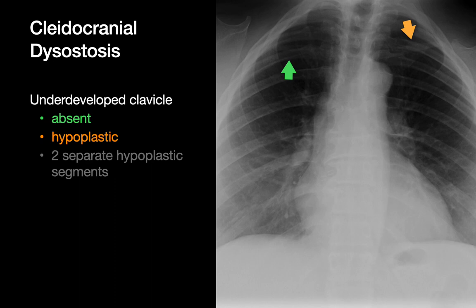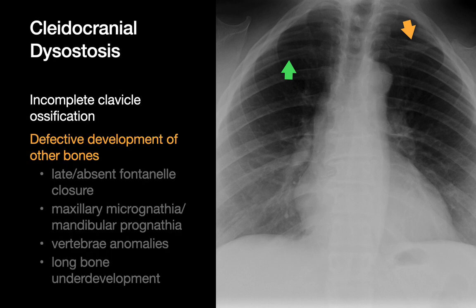Cleidocranial dysostosis is one of the two uncommon congenital chest wall variants to know. In folks with this disorder the clavicle may be entirely absent, as on the right side in this patient, or hypoplastic, as on the left side. Sometimes in cleidocranial dysostosis the clavicle may appear as two separate hypoplastic segments. It's believed to be a consequence of abnormal ossification of the clavicles, and abnormal ossification of other bones can also happen, resulting in features like delayed fontanelle closure, facial bone issues, unusual vertebral bodies, and underdevelopment of long bones.